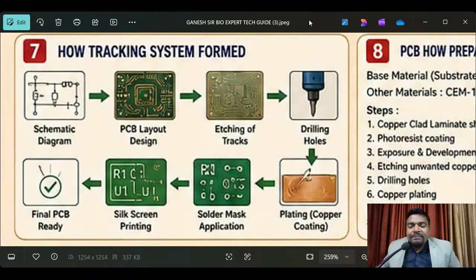Today our topic is the PCB trace procedure, its purpose, every pin-to-pin point and secret points. What I'm giving here is going to be helpful in your service area. Many students do not have the opportunity in their circle, and they are very interested. That's why, if I provide these live sessions, many people can watch my sessions and get the instructions. Okay, right?